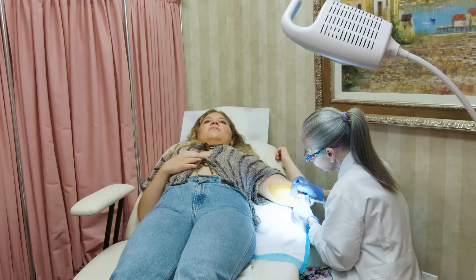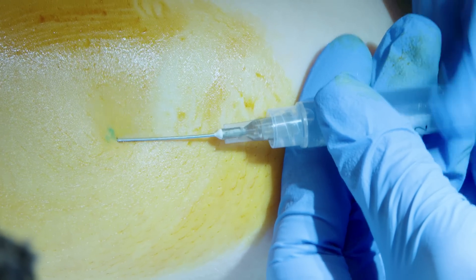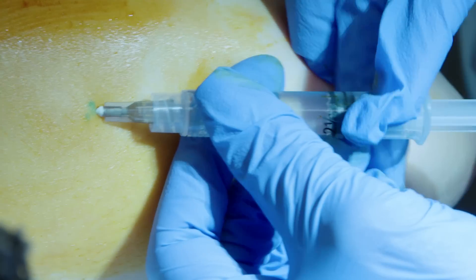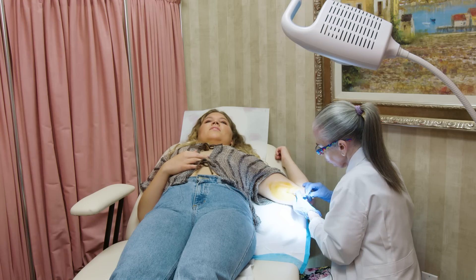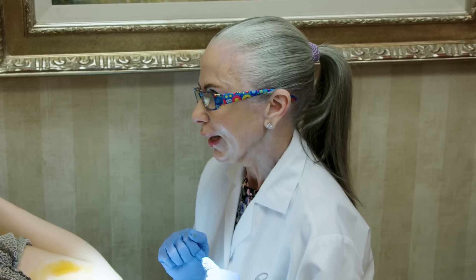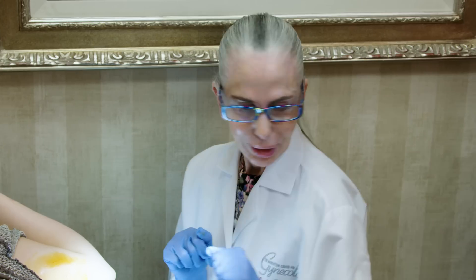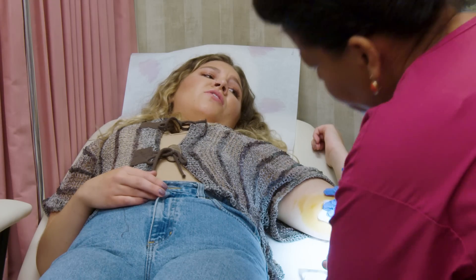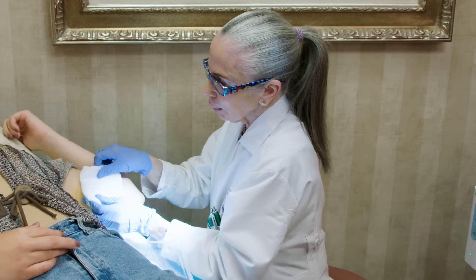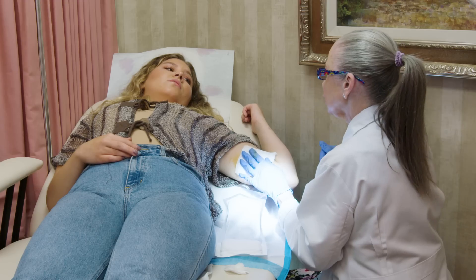You ready? Yeah. How was that? Not bad. You'll be fine — it's worse than your gums. I agree. So is this going to make my whole arm go numb? The numbness will probably only last 20 minutes — everybody's different. You may feel that your fingers are a little numb. And we're almost done.